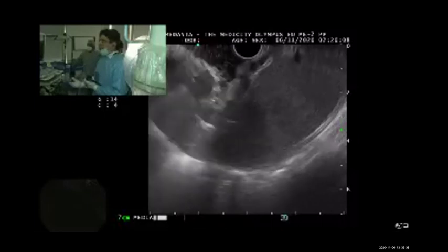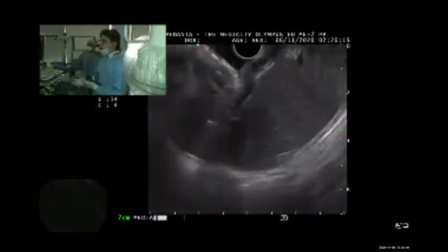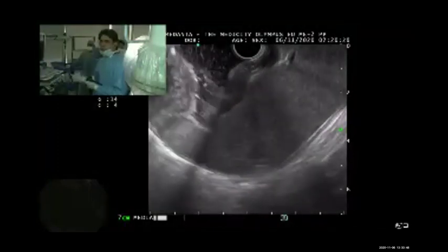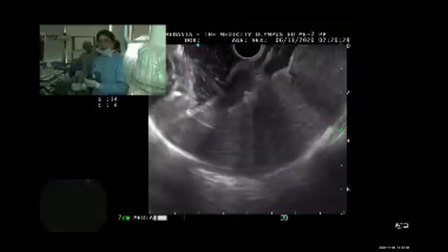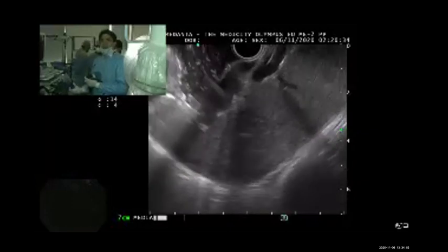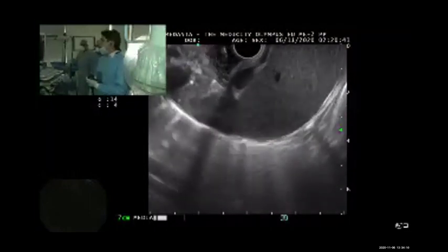In this case, if you do it endoscopically, we will never be sure how much glue we have injected. With the touch technique, we try to see if it is solidified. Many times, endoscopically, people inject inside the mucosa, and that gives the feeling that you have completely injected the varix with cyanoacrylate glue. But in real time, the patent varix is below the mucosa. So with EUS, you are very sure that you have completely obliterated it, and you can see this vision here.